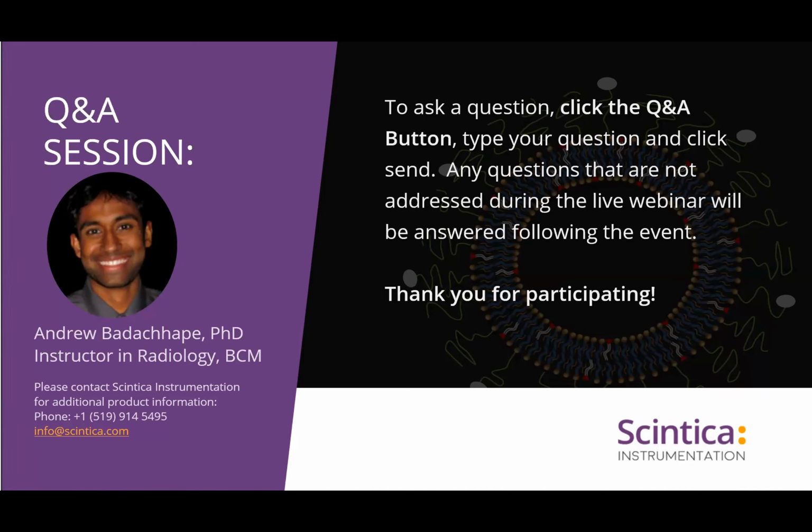This is, however, another reason to talk about a very important question that someone asked about, the time scale. We've been talking about the time scale for these experiments because of the gadolinium agent that we're using, but you also have to be really careful about your imaging and have to be relatively efficient, because if I'm scanning all day, again, there's going to be actual changes. So I try to have a relatively quick scan protocol in the order of about 30 or so minutes, even for these contrast enhanced scan protocols, which is really important for doing preclinical imaging of pregnancy.